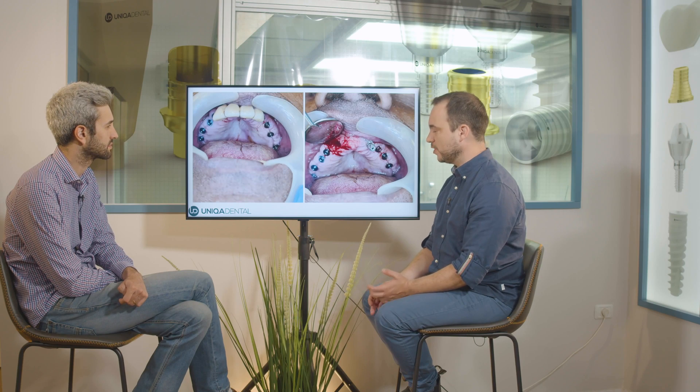When we received the bridges, you can see they are without any implants in the frontal area, because we knew those implants would come out — the body rejected them, there was inflammation. It's hard to say exactly when, but we'll take the implants out with the crowns and in the same appointment mount the new bridge on all the other implants.